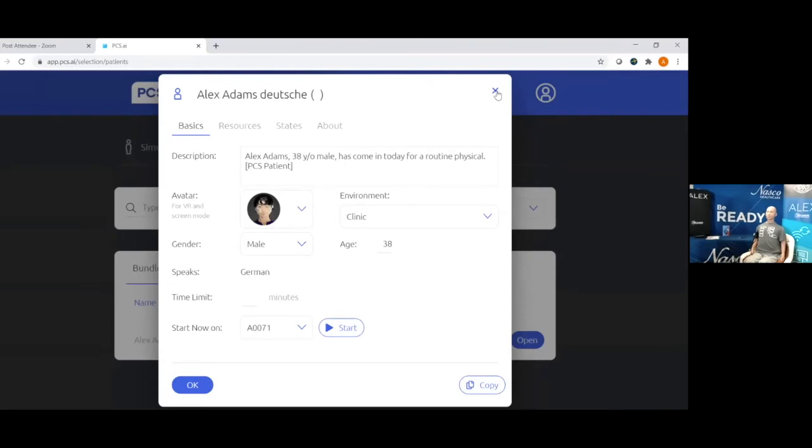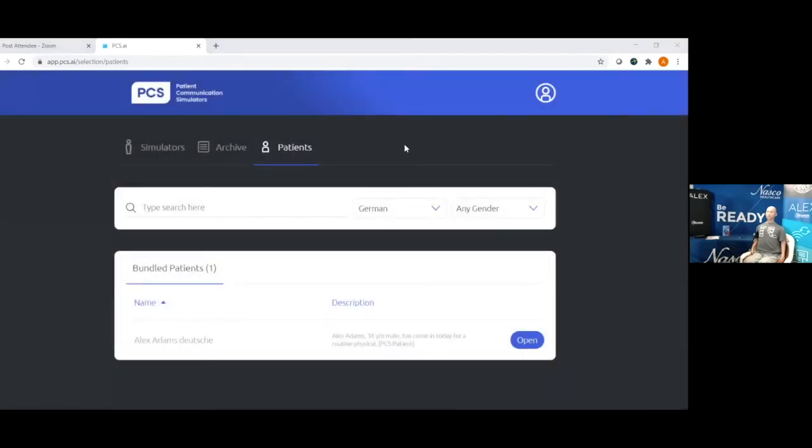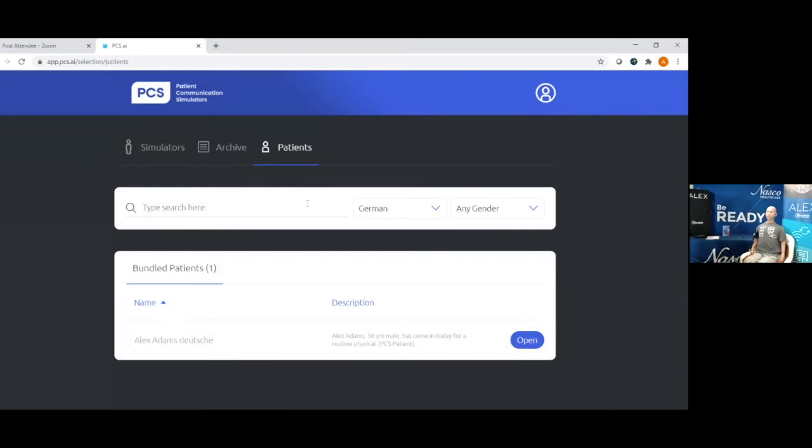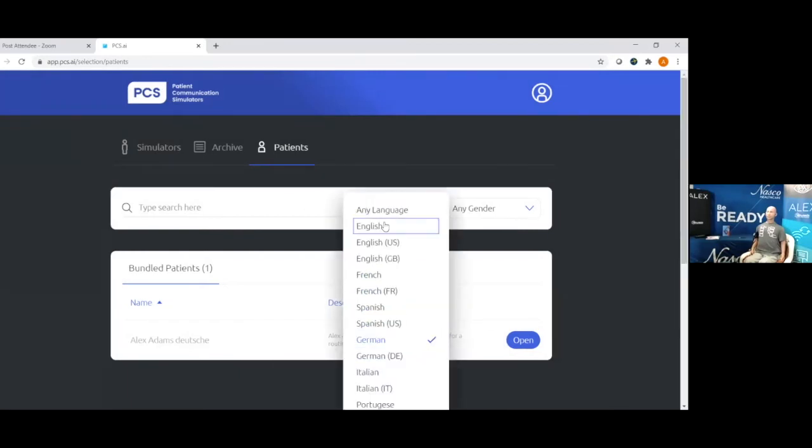Okay. In this case, you would be able to type your avatar in there. I'll open that back up again. Sorry. You choose your avatar, which there are, I believe, 10 or 12 avatars that we can choose from. Why is it not open? There we go. It's not opening up. You can change male and female. I don't think I can do that right now because it's a new one. I'll go back to my English one to show you.